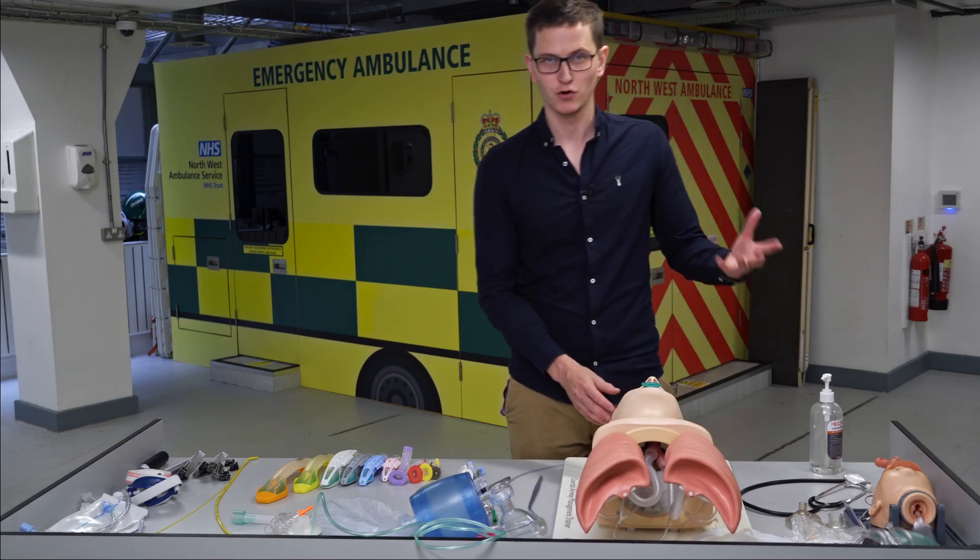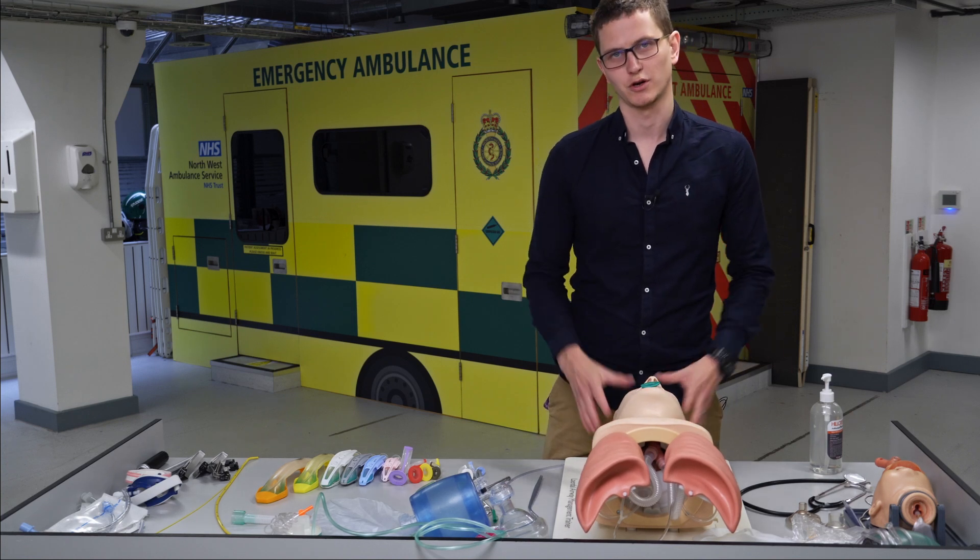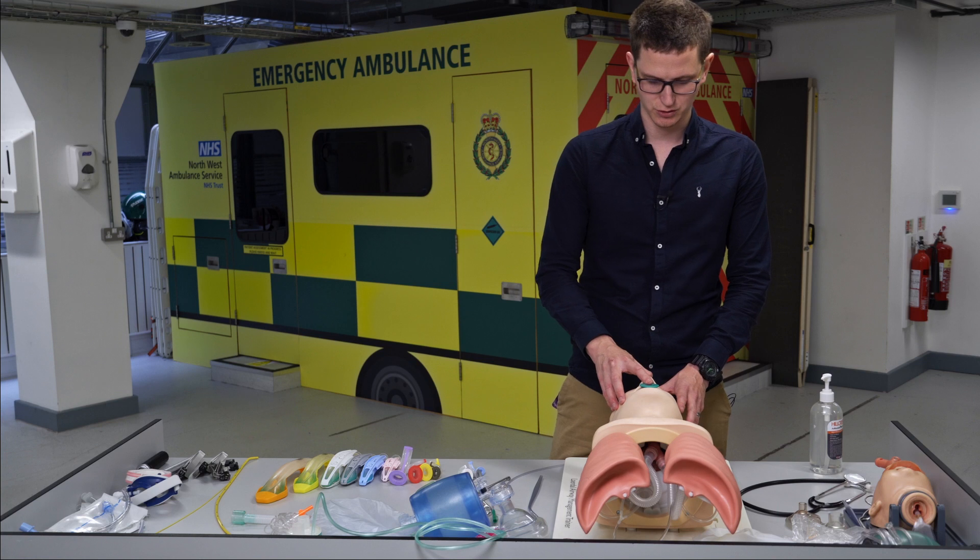If the OPA is too big, it can occlude the trachea and get in the way of the airway. If it's too small, it won't do the job and could become a choking hazard, especially when dealing with children.